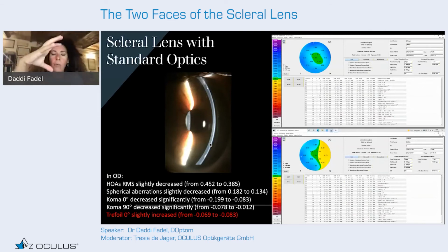And to have a very well-centered lens, we need to customize the back surface of the lens. So if you have a diagnostic lens with front surface eccentricity of different values, you may apply them and see which one of these lenses allows a better high order aberration profile. And you can verify it with this Zernike analysis. But you need to be aware with front surface eccentricity, because the diagnostic lenses are not customized fitted lenses, as I already said.